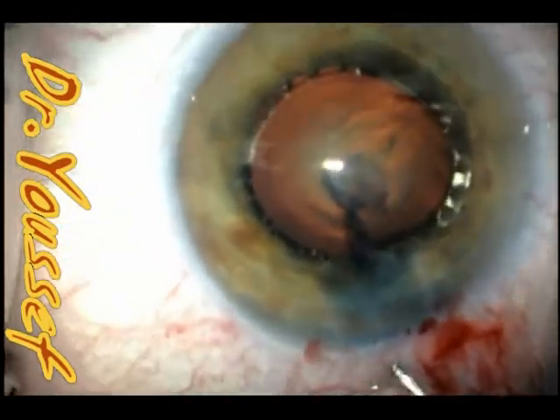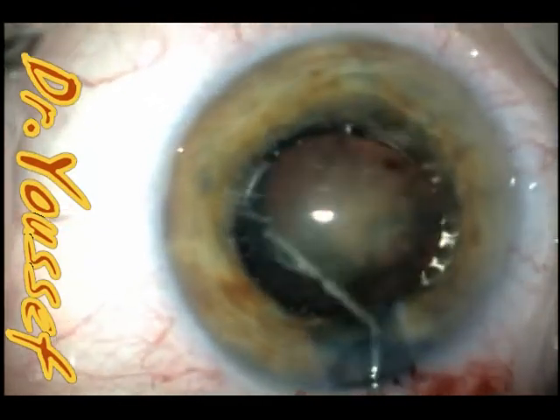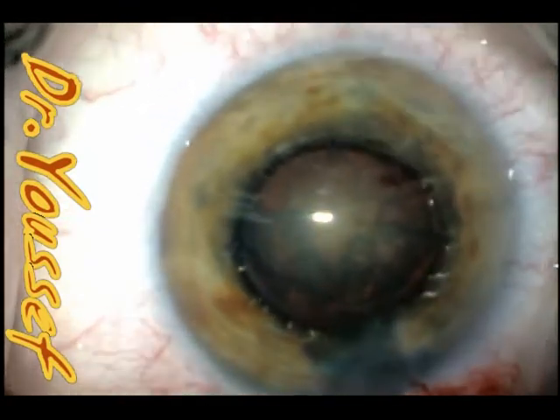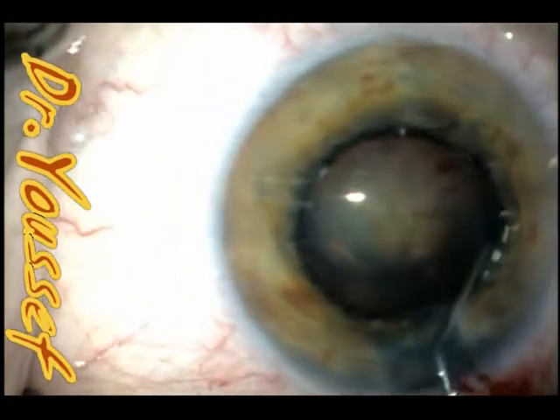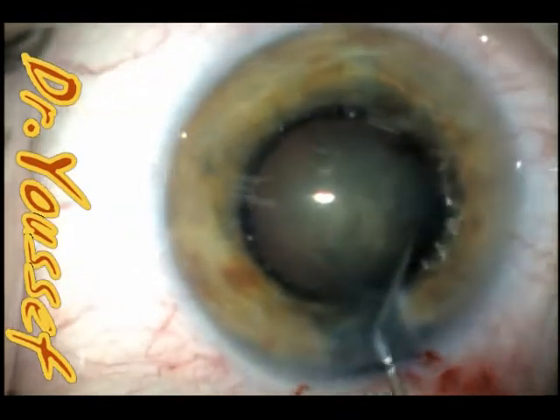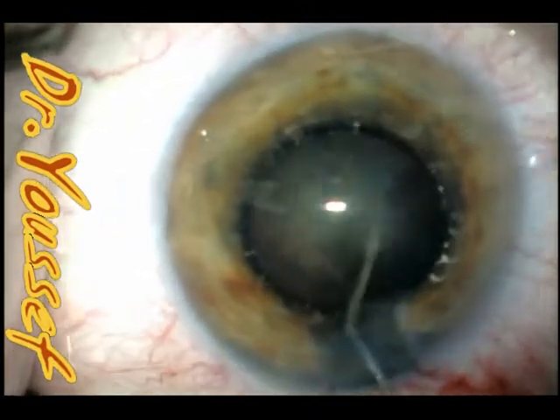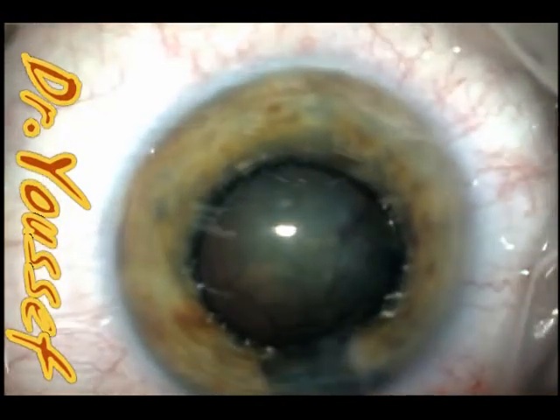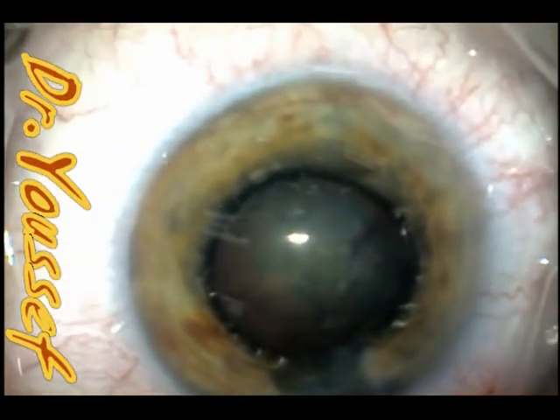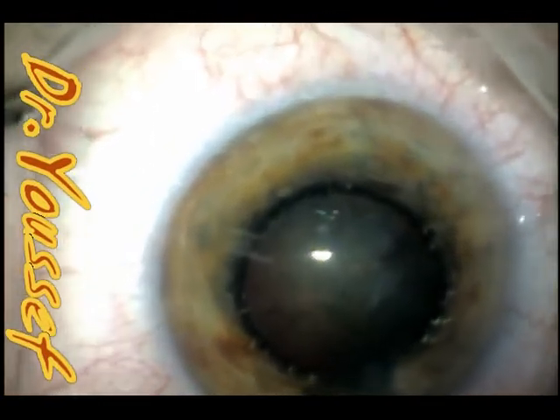We proceed as usual with the hydrodissection and hydrodelineation and nuclear rotation. You can see some of the vision blue still coming from underneath the iris, because we injected the vision blue beneath the iris blindly before we dilated the pupil — it still comes out there.